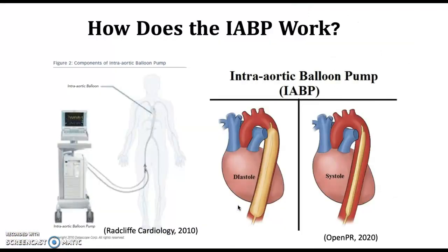So how does the balloon pump actually work visually? Here on the right-hand side, you see that the balloon pump rests in the patient's descending aorta, right along this vessel. The balloon pump therapy is initiated by inserting a dual chamber balloon, as shown here in the photo, through the femoral artery. Down on the left-hand side is where they go in, and then they string the balloon up into the descending aorta. The balloon is inserted percutaneously and can be done at bedside or under fluoroscopy.